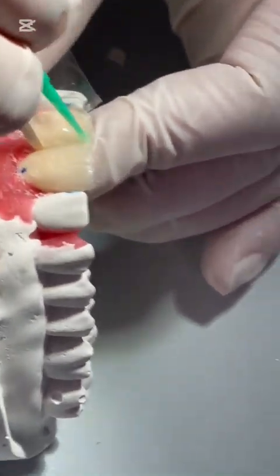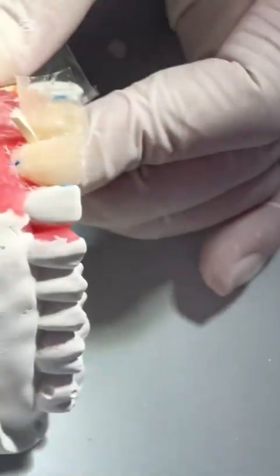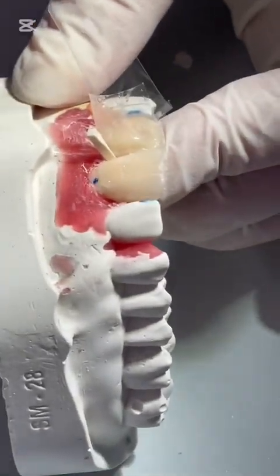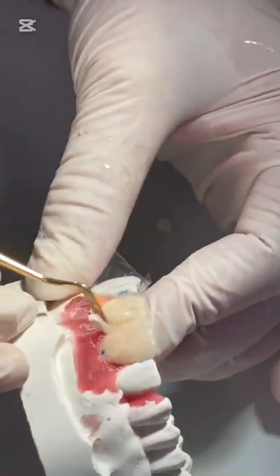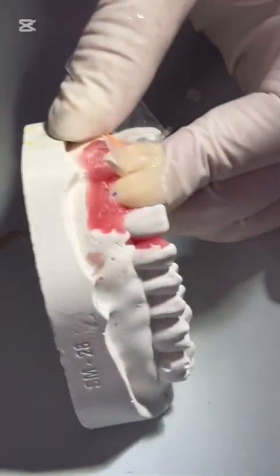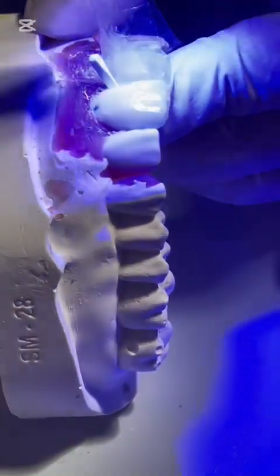Hocam, peki normalde kompozit şekillendirirken, şu an yaptığınız gibi flowable kompozitten... Ben flowable kompozit el aleti temizlemek için kullanıyorum çünkü yapışıyor. Sticky and instrument interface. That's right.